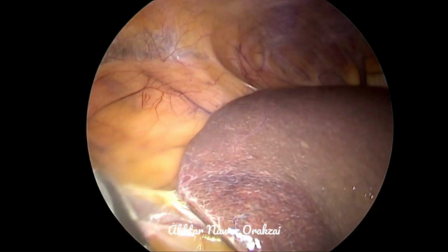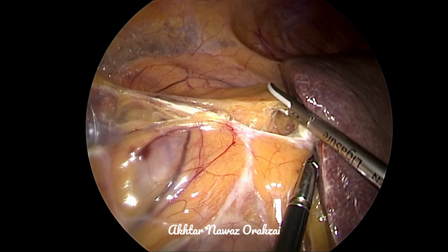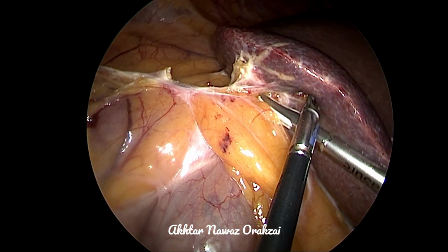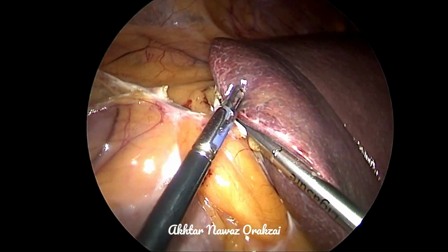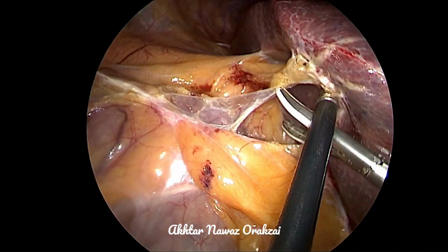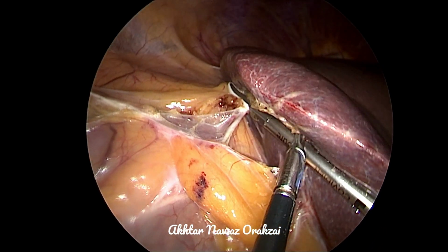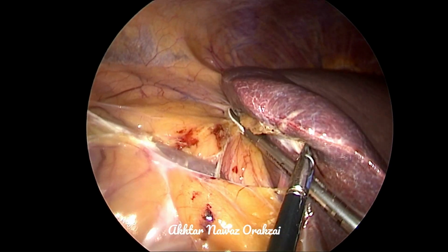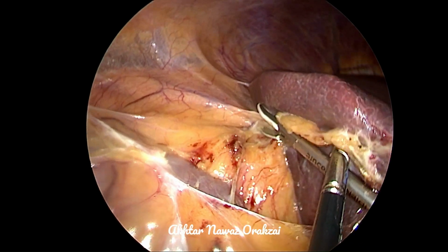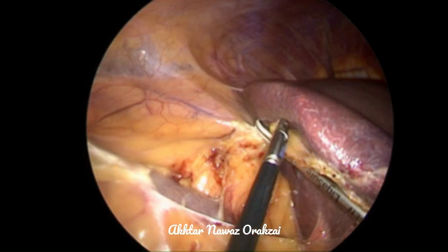Today's case is right radical nephrectomy, laparoscopic, for a tumor on the posterior surface of the kidney. This part of the procedure is included because there was a difficulty mobilizing the liver. As we all know, the liver has to be mobilized if it is attached to the structures here and there, so that it can be lifted and retracted in order to properly deal with the kidney.